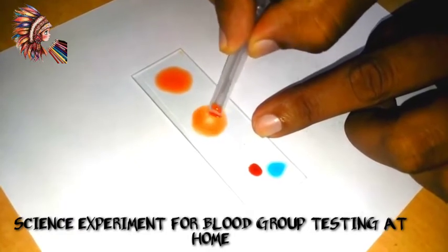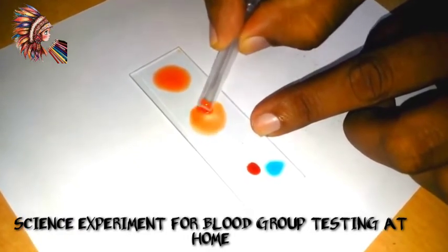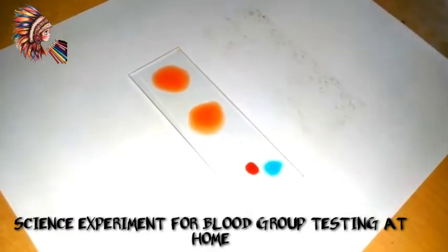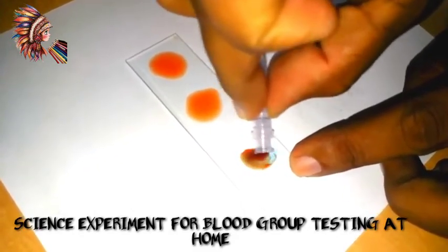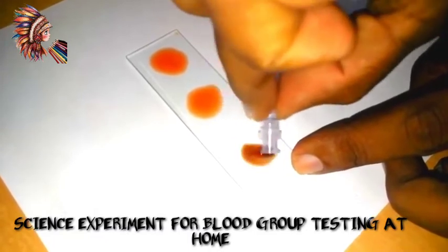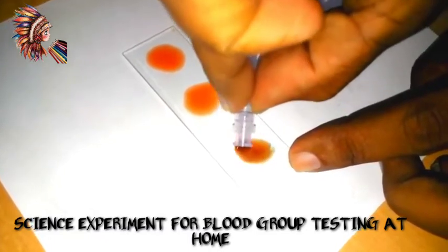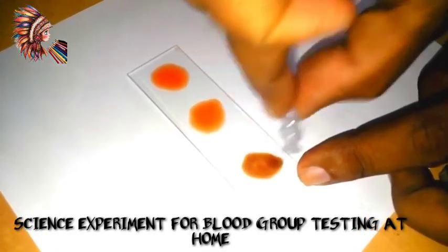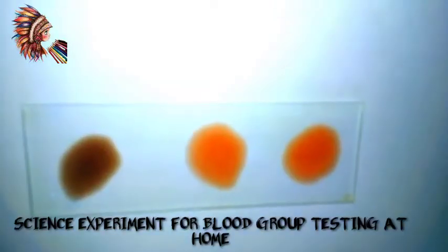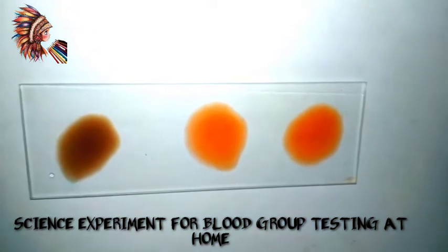Just do not mix it from the same side. I am using another side of the tip. You can see the middle cap and from the back side. Now they're mixing it. Wait for two minutes, shake it a little bit, and then you will properly see the reaction.